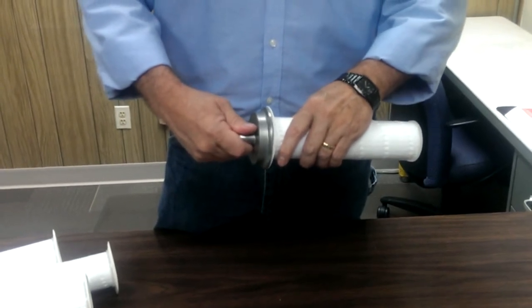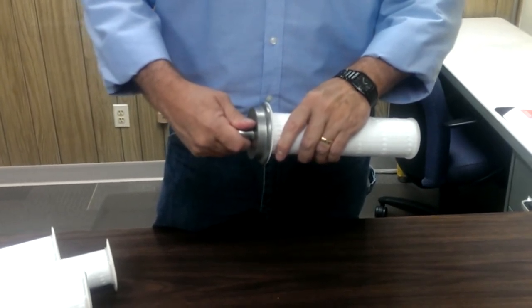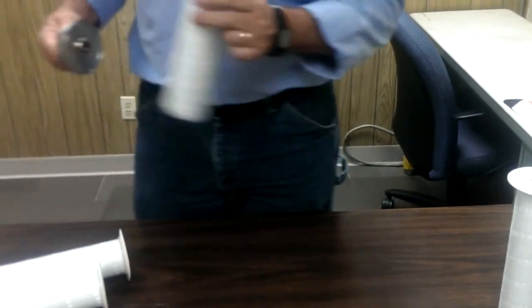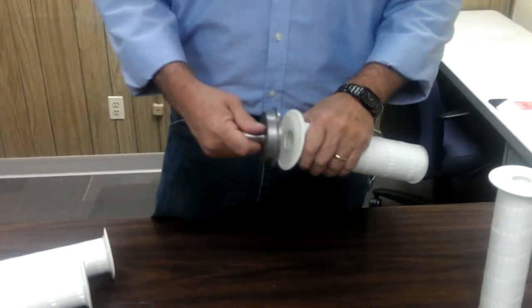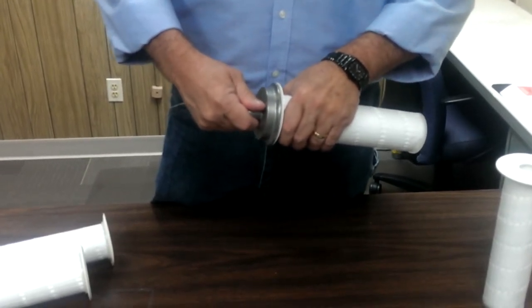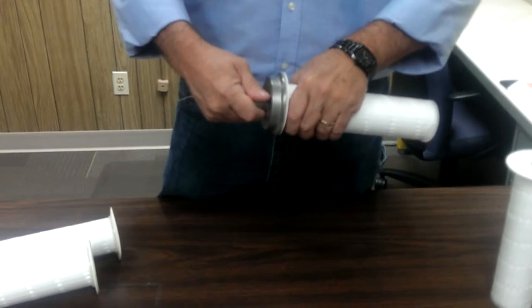If it rocks and does not insert completely and flush, it's a bad filter. It doesn't matter if you go at an angle or straight in — the filter should sit flush to the cap.